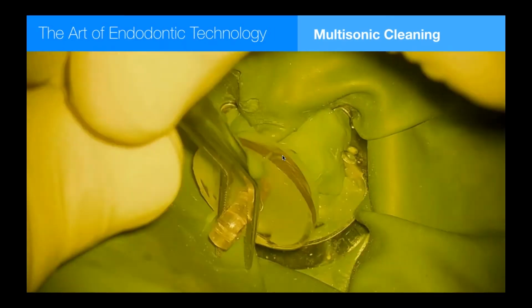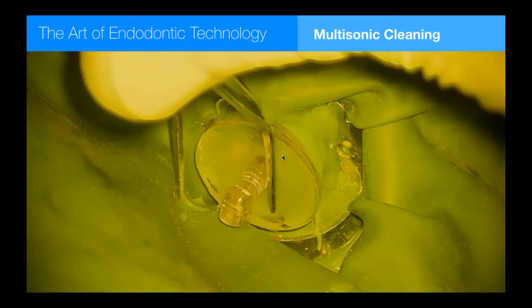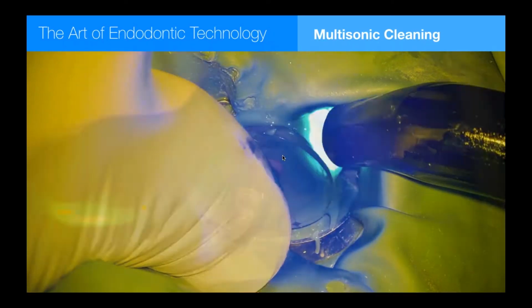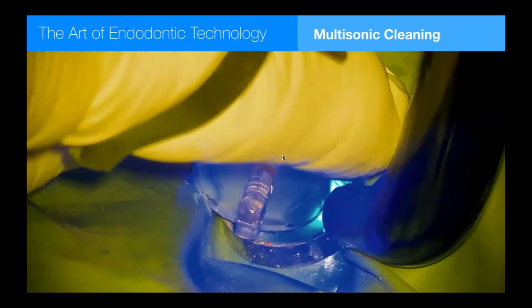Here's the staging form for the top. You coat that, put it onto the Sound Seal that you've already put on the tooth, light cure it, and you're most of the way there. So I do light curing around the edge of it.